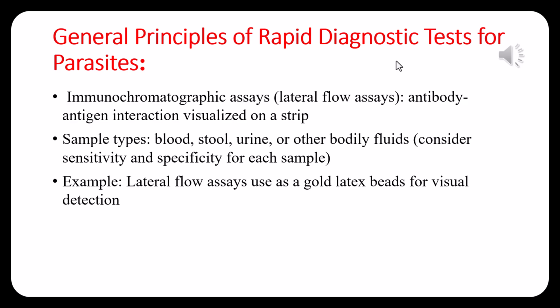For example, we have the lateral flow assay, which uses gold latex beads for the visualization of detection. That is the name of the rapid test we use mostly in our laboratory. What does it mean?